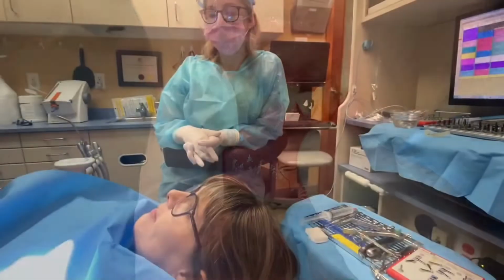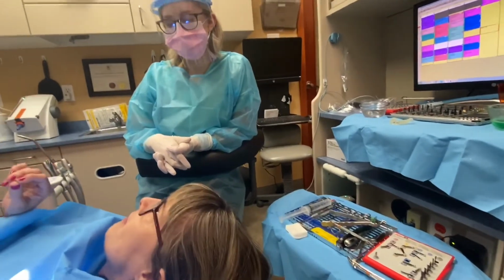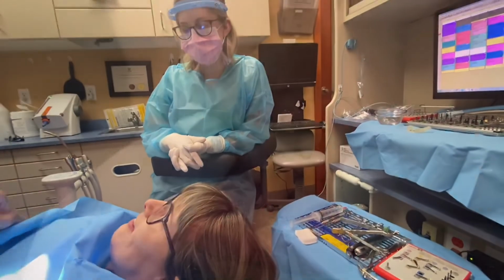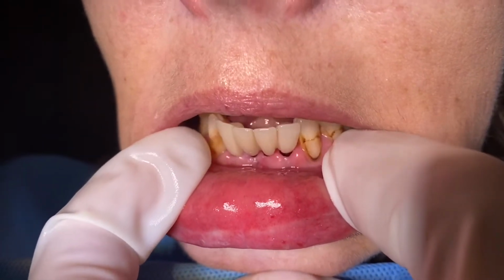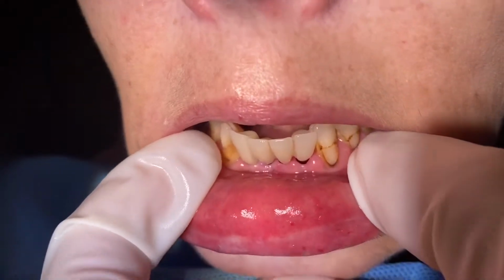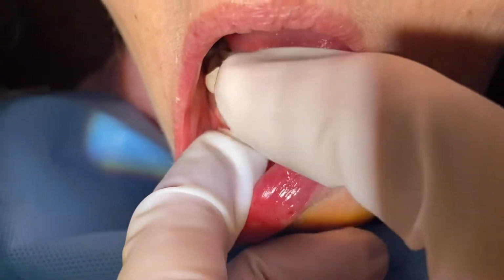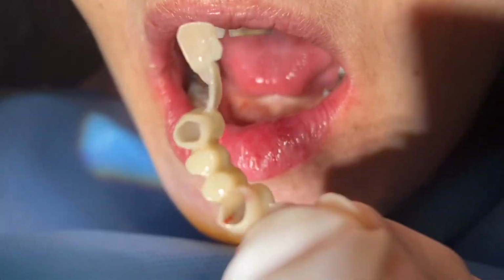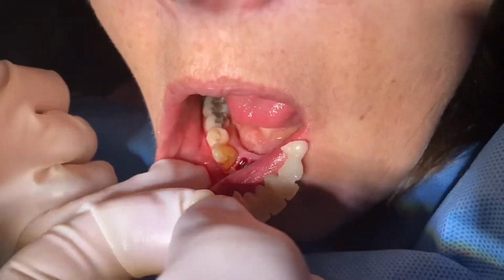But we'll take the teeth out, extract those. They come out pretty easy. And this patient is cooperating quite well, and we have the ability to try the temps in now. So we'll lay the wings on the adjacent teeth, and we'll just see how they look and see what the positioning of the tooth position is, because really we can see it before we even start.